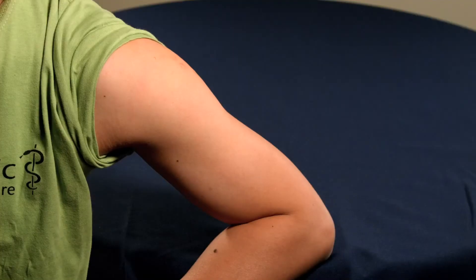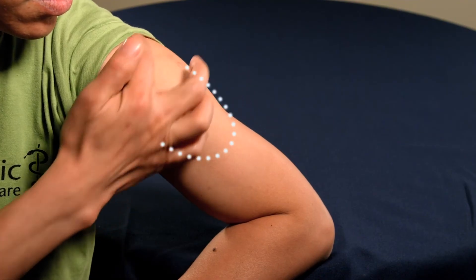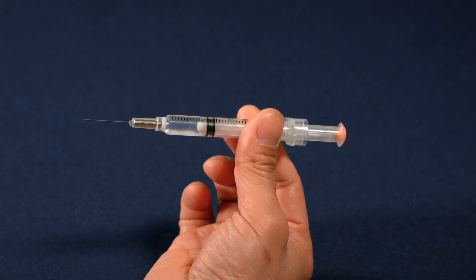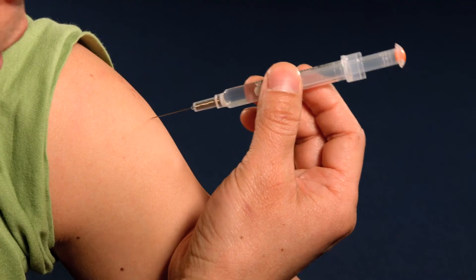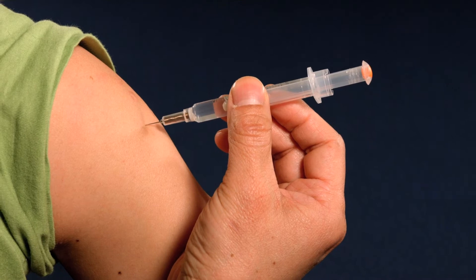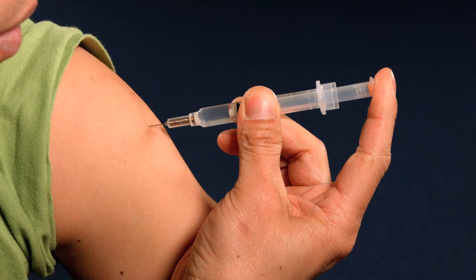The safety syringe needle can be injected into the deepest area of muscle on either your upper arm or the middle third of your thigh. Hold the needle like a dart over the injection site and plunge it into the muscle. Now push the plunger in fully until all the liquid has gone.